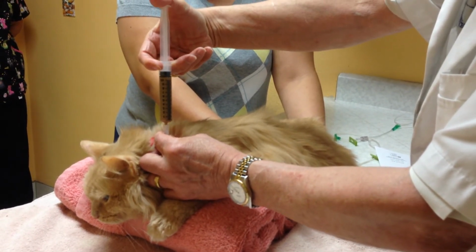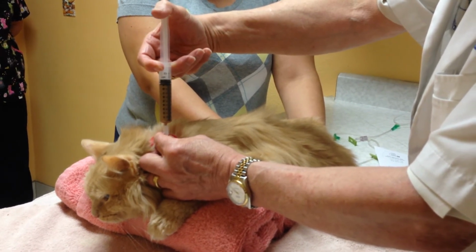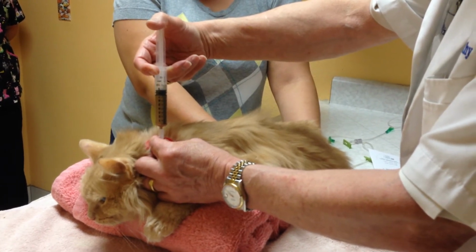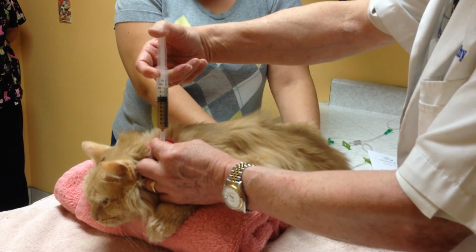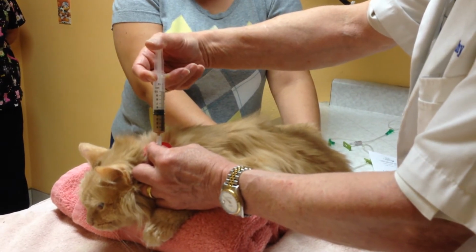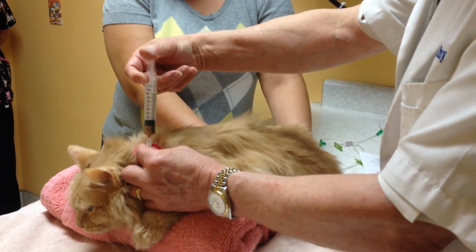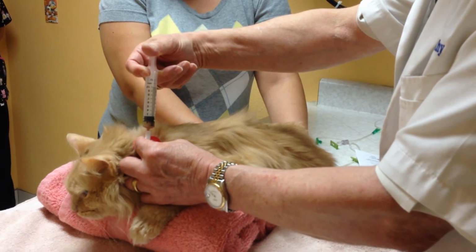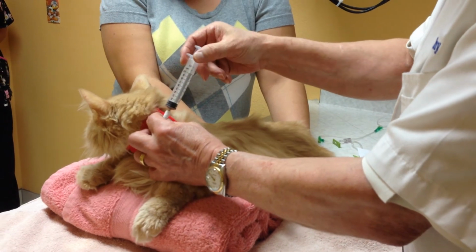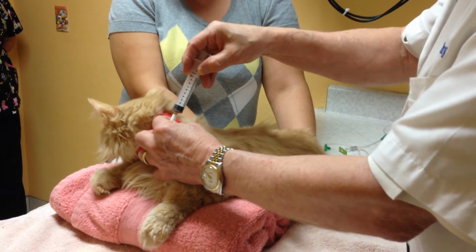Now the second thing to do to keep from getting too much in the esophagus at one time is to go fairly slowly. So we're going to go about 1 cc per second. So this entire 12 cc's of food should take approximately 12 seconds. If it's a bit longer than that, that's fine. After this syringe is emptied, then your instructions will tell you how many syringes will be fed at each feeding. So you'll take this one off, and then you would put the next one on for the next until the feeding is completed.